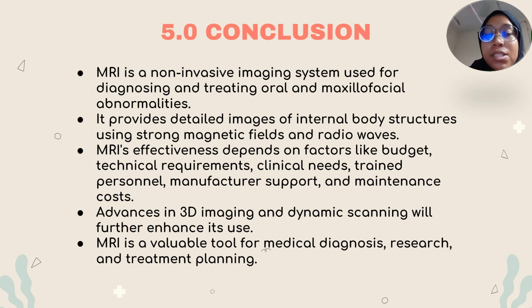As the conclusion, MRI is a non-invasive imaging system used for diagnosing and treating oral and maxillofacial abnormalities. It provides detailed images of the internal body structures using strong magnetic fields and radio waves. MRI's effectiveness depends on factors like budget, technical requirements, clinical needs, trained personnel, manufacturer support, and maintenance costs. Advances in 3D imaging and dynamic scanning will further enhance its use. MRI is a valuable tool for medical diagnosis, research, and treatment planning.